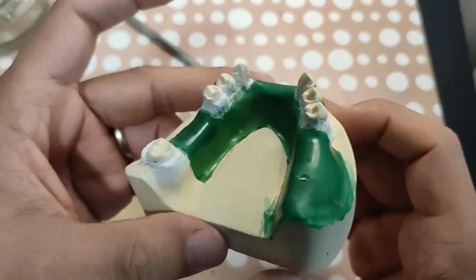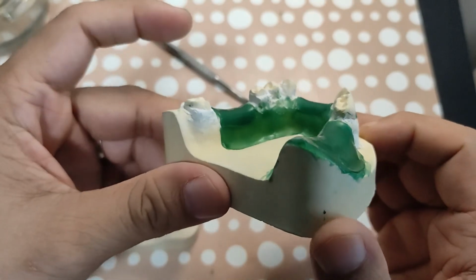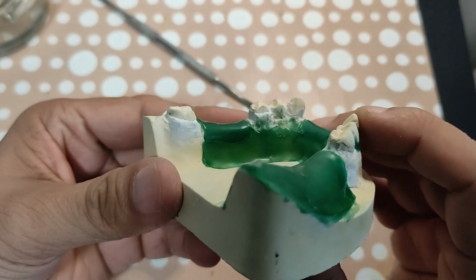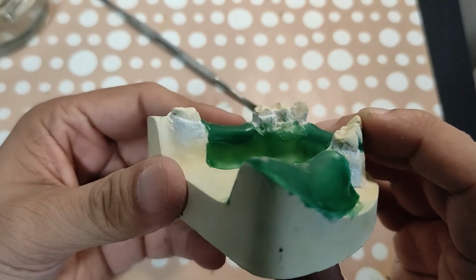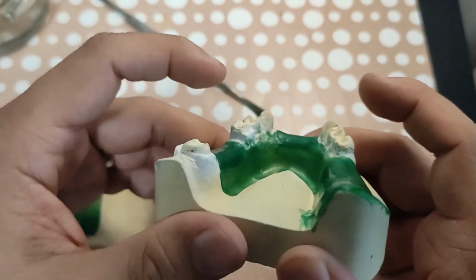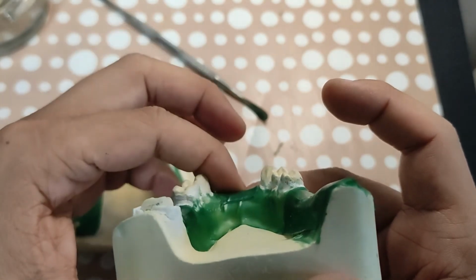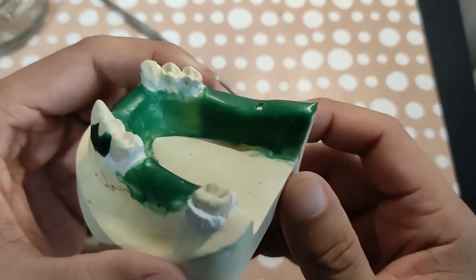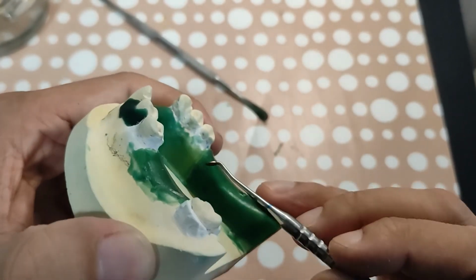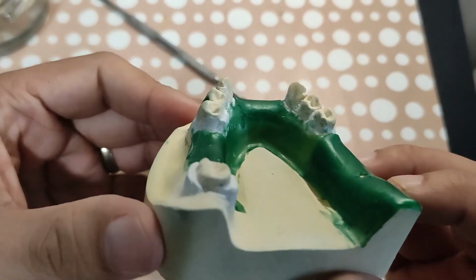Okay, so this is the finished cast preparation for the lower. Notice the distinction between the first and the second layer, so as to create a way to fabricate an internal finish line. Okay, there's one here, the posterior, another here, the anterior. See the distinction between the two layers, and the distinction between two layers here as well for the distal extension base. Okay, kailangan magkahiwalay silang lahat.